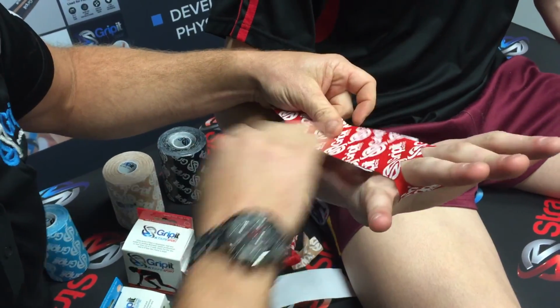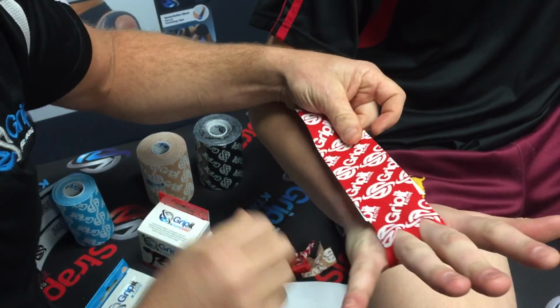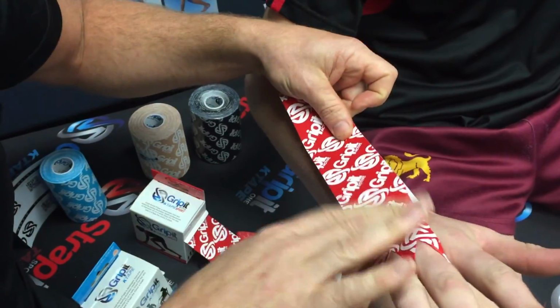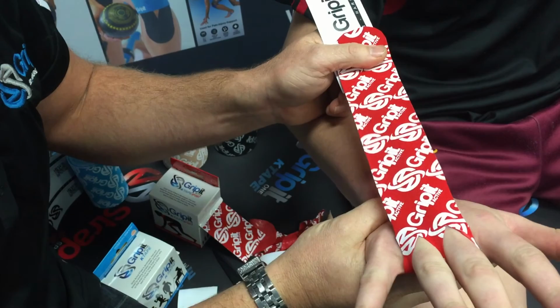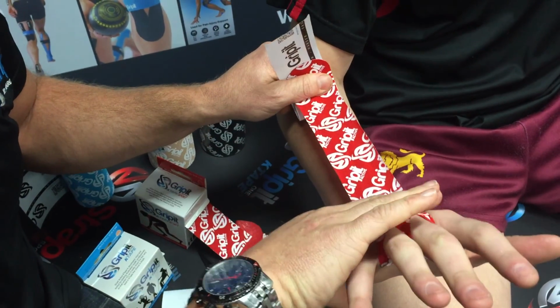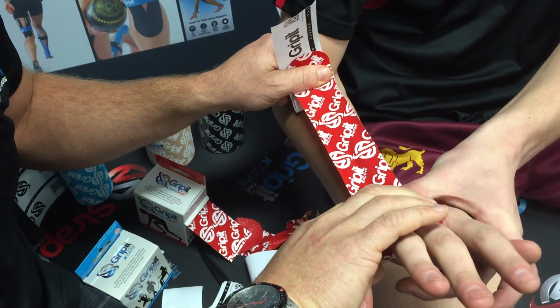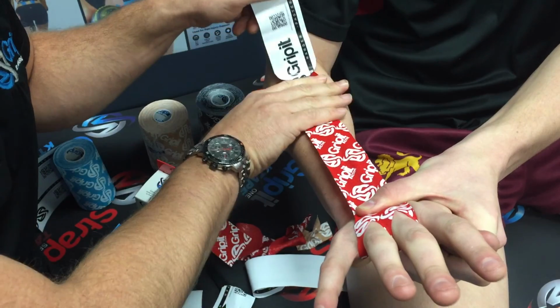This is called the dorsal aspect of the hand and wrist and arm, okay? So we lock down our anchor there. And you can see now we've got this awesome, real strong anchor here. All right, so extend the tape. Now we get Daniel again to arch, that's it. Now this time I will ask him again just to hold that down a bit there. So just grab that, buddy. Yep, awesome, okay. And so again, really, really strong tension here.